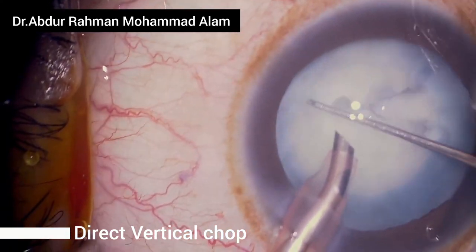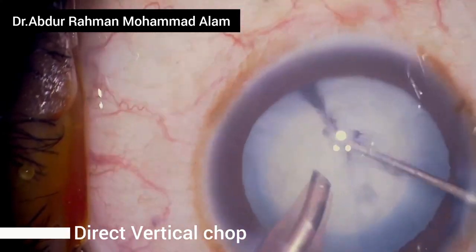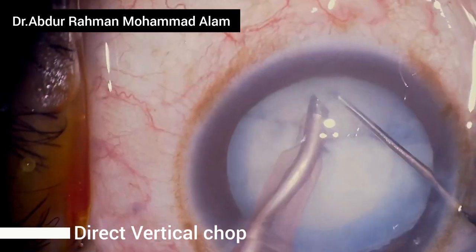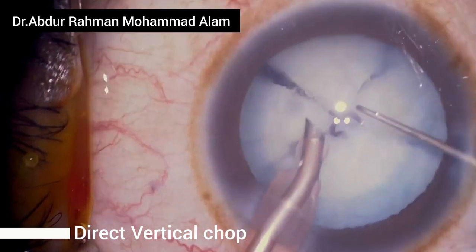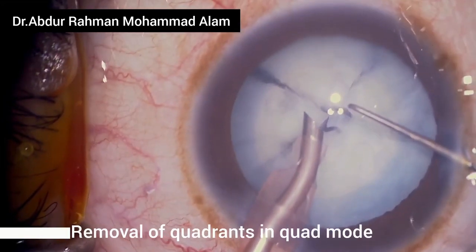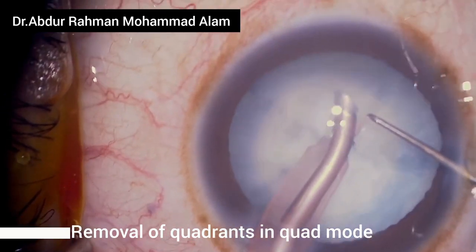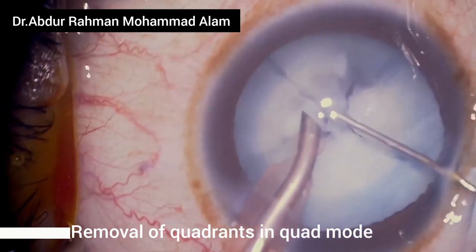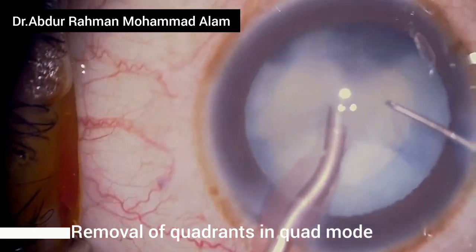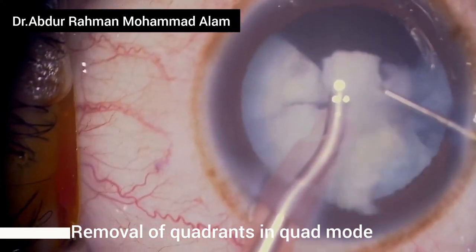Now rotate and chop another quadrant, then chop this hemi-nucleus. I now have four quadrants which can be easily removed with the phaco handpiece. Be careful while removing the cataract quadrant from the capsule, because the phaco handpiece may easily cross through the quadrant and cause a posterior capsule tear.